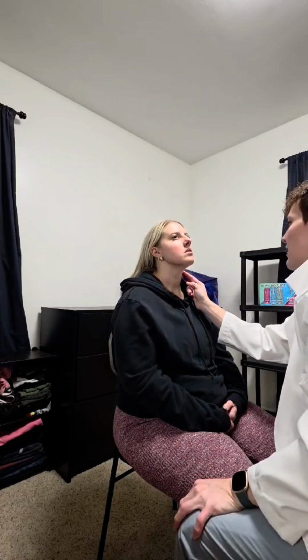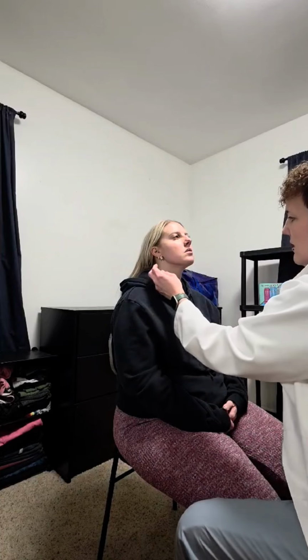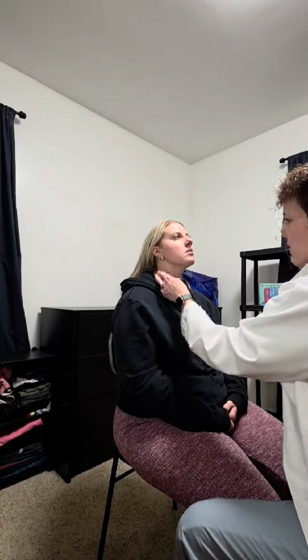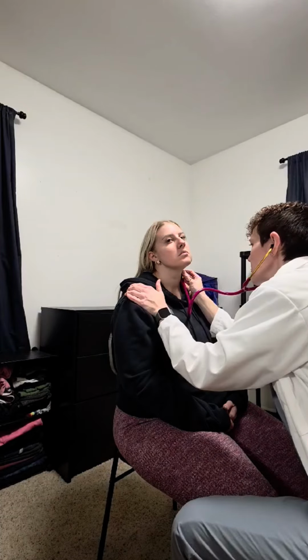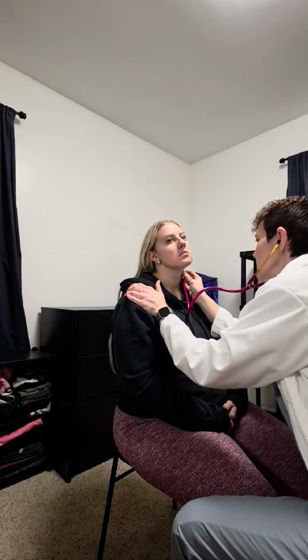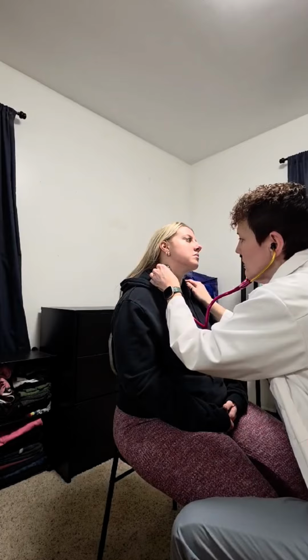I'm going to check your pulse over here. Plus 2. I'm going to go ahead and check the right side. Also plus 2. And then I am going to take a quick listen. All right, no bruits heard on either side.